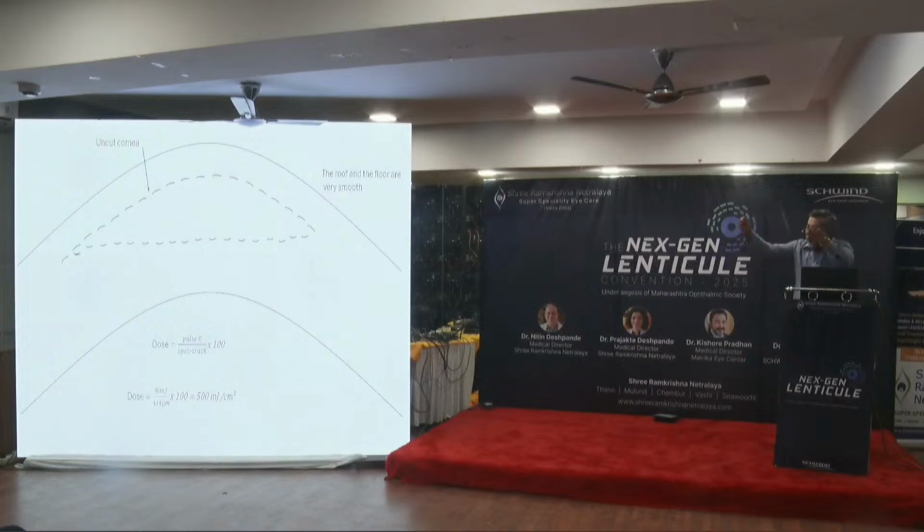Now what to do with this? Just take it closer. You could. So many laser companies still do it like this. Why? When you bring the whole thing closer, the repetition of the tracks, the number of spots that you put in, is as simple as doing phaco. Your phaco machine has a phaco power. You can reduce the phaco power and carry on doing surgery for 1 hour 45 minutes, and tomorrow morning you'll have a white cornea. So this is what the whole concept is.